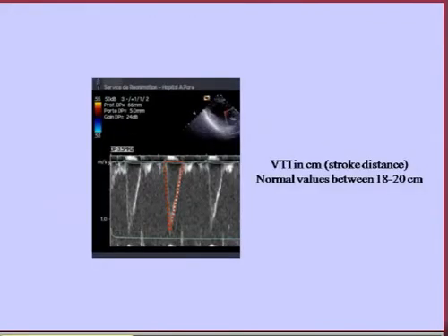Yesterday, some of my friends in this room told me that it was a pity not to speak about cardiac output measurement using echo. So this is for my friends. Of course, echo is very valuable for calculating cardiac output. But when I want to do it, I much prefer to monitor the stroke volume rather than the cardiac output.